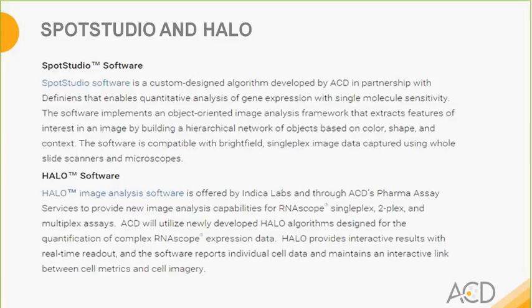SPOTSTUDIO is a custom-designed algorithm developed by ACD in partnership with the company Definiens that enables quantitative analysis of chromogenic single-color RNAscope assays captured using whole slide scanning systems.